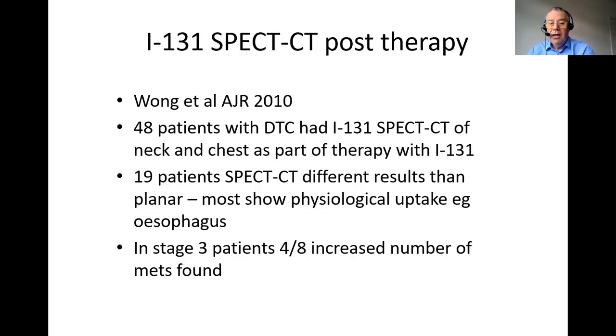Iodine-131 post-therapy: a publication again about a decade ago showed 48 patients with differentiated thyroid cancer that had iodine-131 SPECT-CT after their therapeutic dose of iodine-131. And they showed that there was a different result when you use SPECT-CT. Most commonly, patients were reported on planar as having residual uptake in the upper neck, but with SPECT-CT, this was found to be in the esophagus. However, in a few patients, additional lesions were found which were significant, and the patients were restaged into a higher stage.